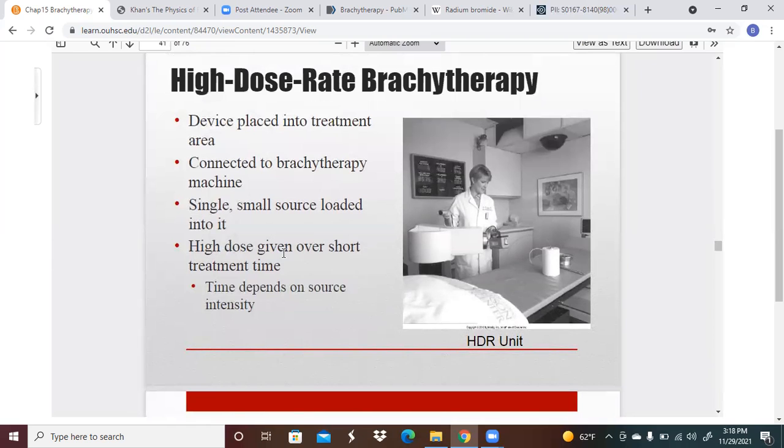And usually when you end up doing decays on these particular plans, the topology of what it is that you're treating generally doesn't change, so you can decay the plan. So the time is going to be a little bit longer for each subsequent treatment.